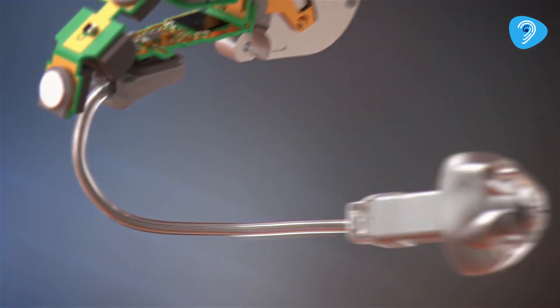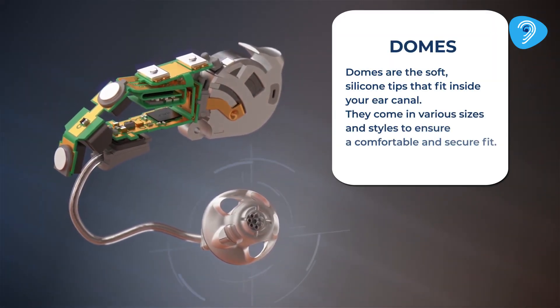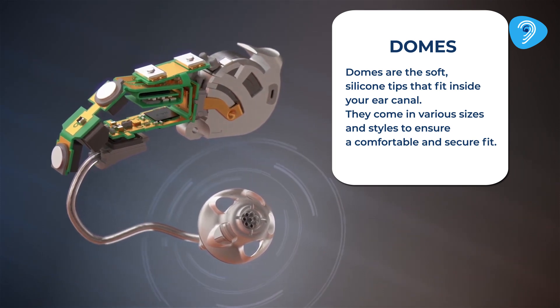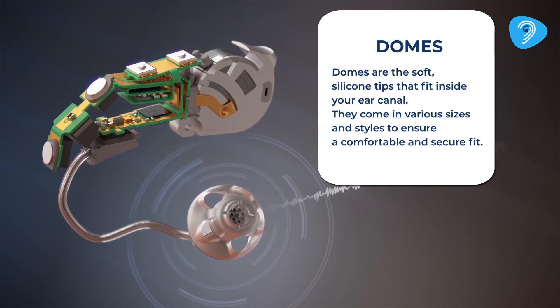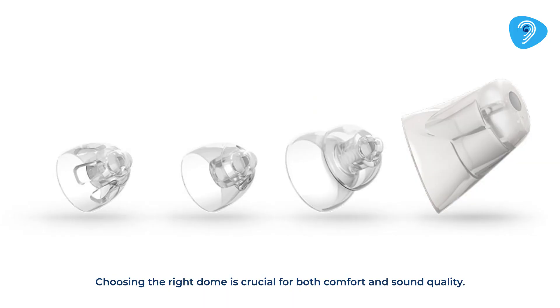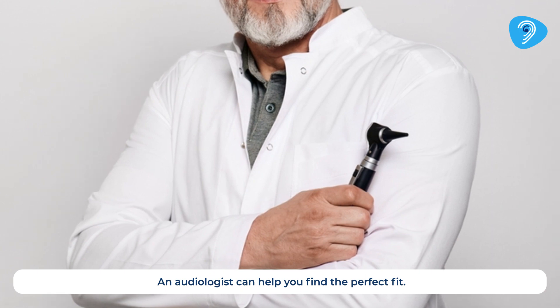Domes are the soft, silicone tips that fit inside your ear canal. They come in various sizes and styles to ensure a comfortable and secure fit. Choosing the right dome is crucial for both comfort and sound quality. An audiologist can help you find the perfect fit.